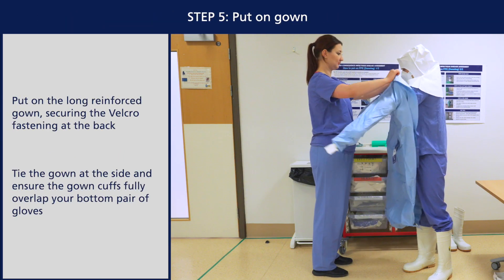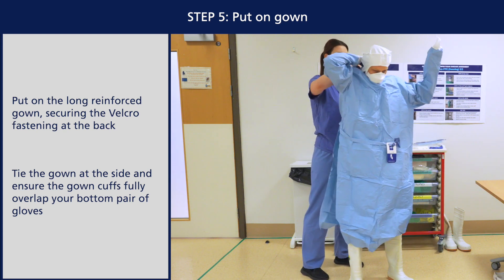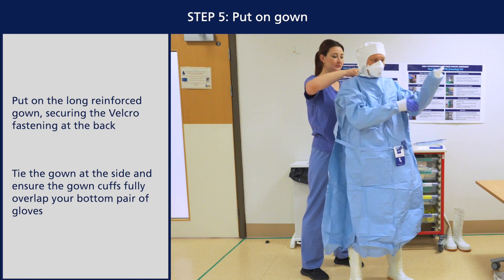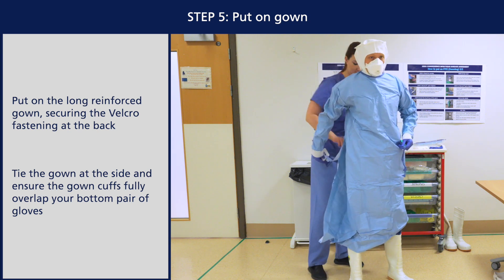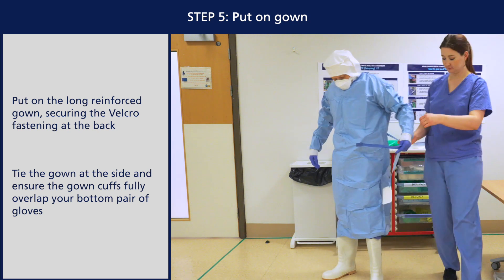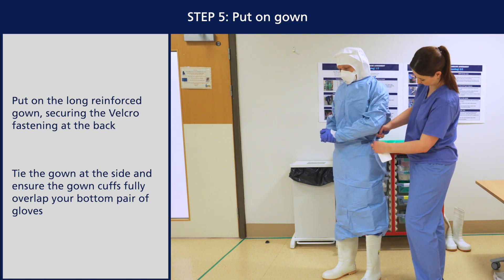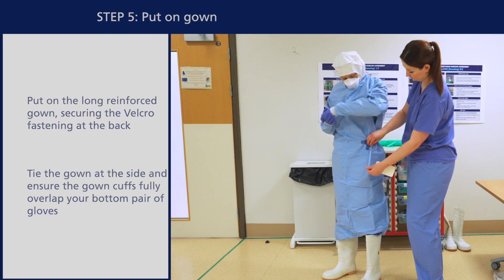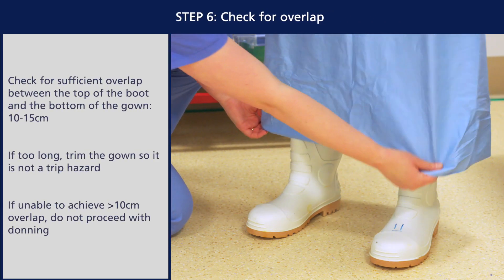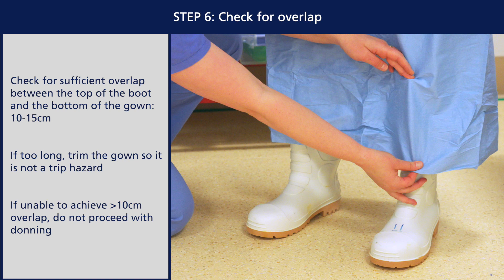Put on the long reinforced gown, securing the velcro fastening at the back. Tie the gown at the side and ensure the gown cuffs fully overlap your bottom pair of gloves. Check for sufficient overlap between the top of the boot and the bottom of the gown, aiming for 10 to 15 centimetres. If required, trim the gown so it's not a trip hazard. If you're unable to find a gown that achieves a 10 centimetre overlap, you should not proceed with donning.